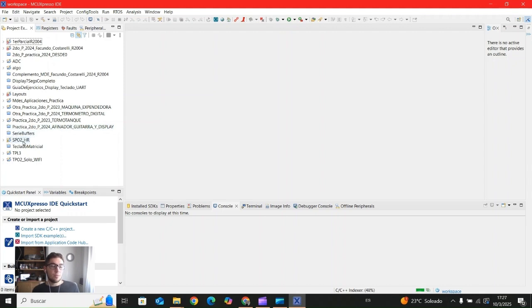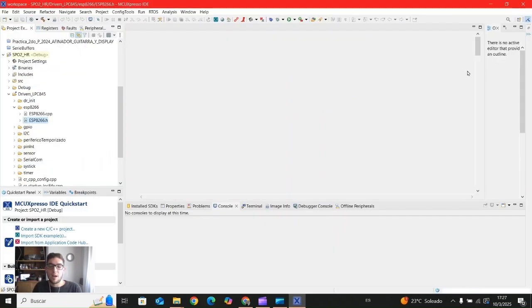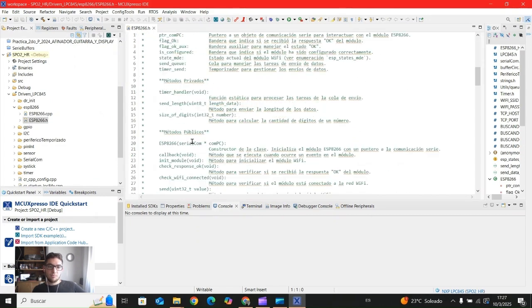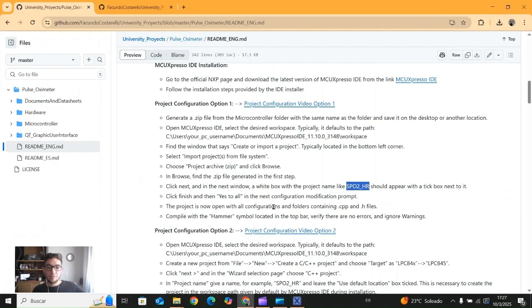So then we click on the folder and we can see, for example, drivers, maybe this one, just to open it. I'm going to find out that it is the same file compared to the GitHub file that we have. Now after that we just need to compile.